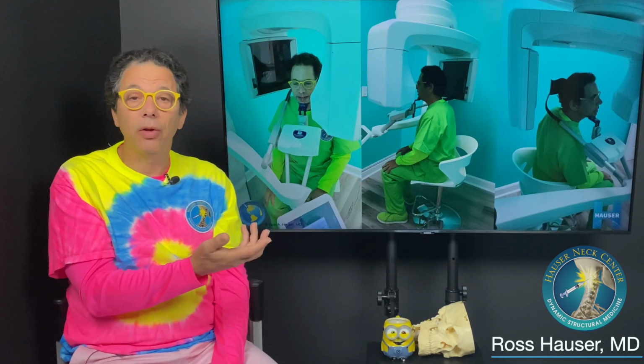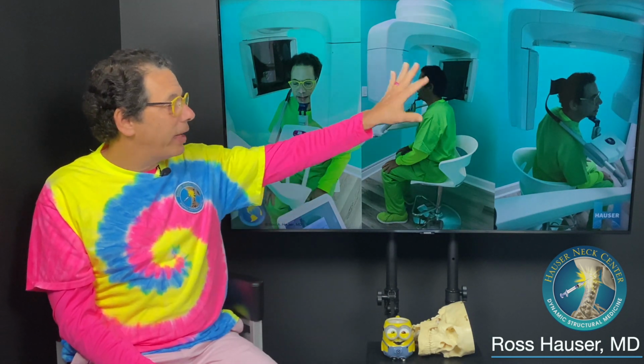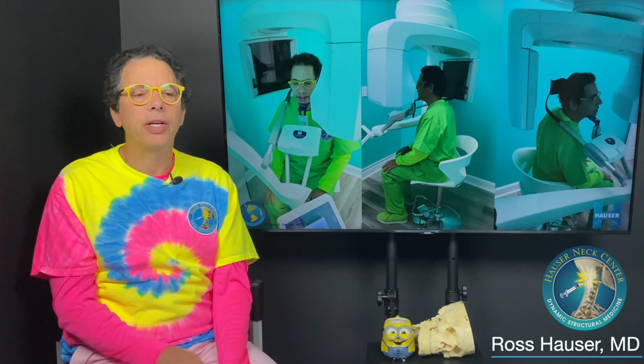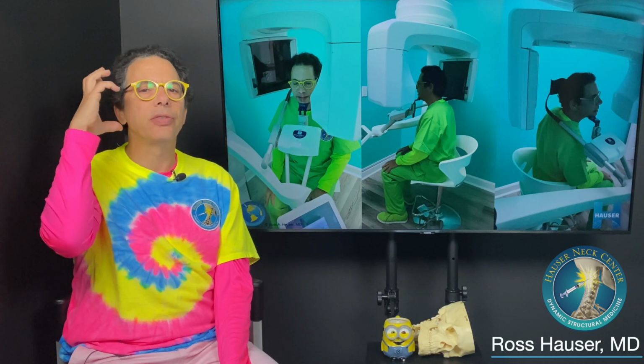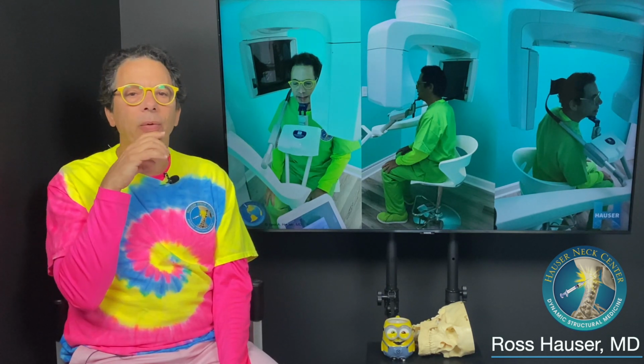And this is actually what it looks like. This is me in it. You could see it's upright. It's not very big. The whole scanning takes like less than 5 minutes. When the scanner is going around the person's skull, their jaw, their neck, that only takes like a minute.